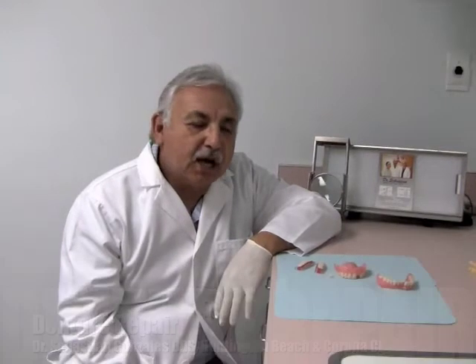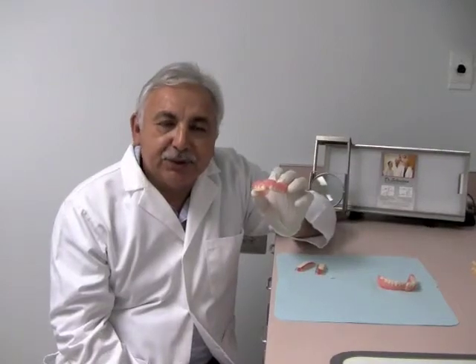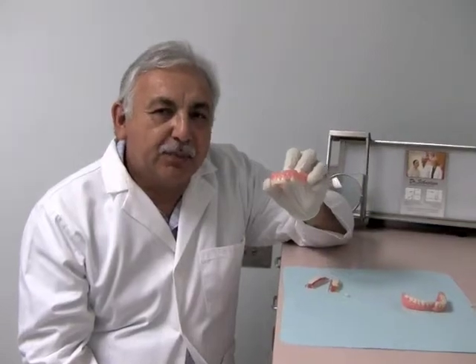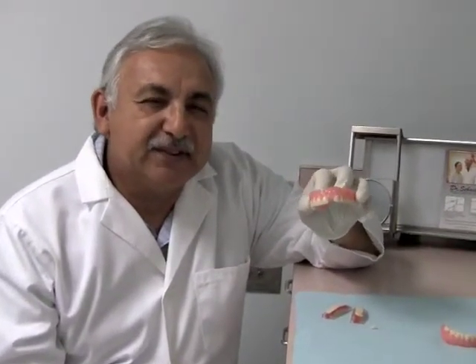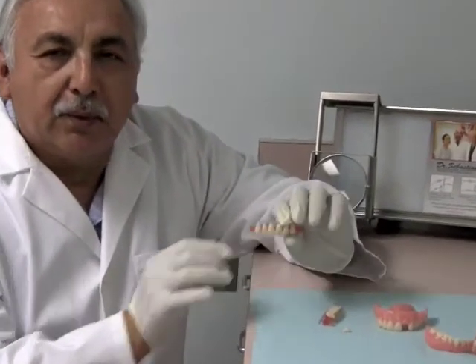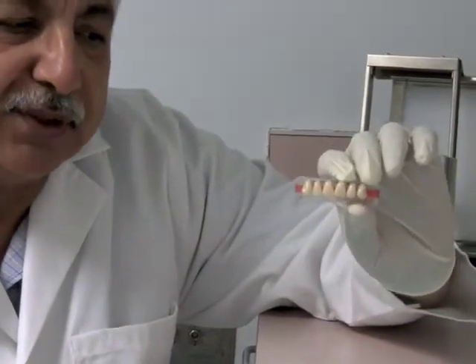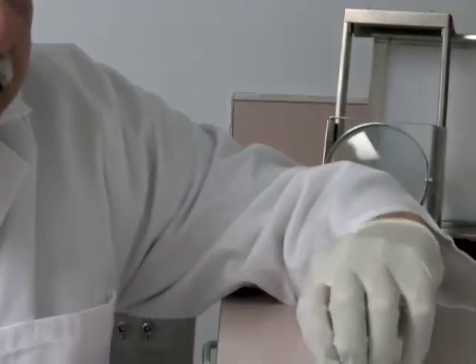The first most common problem is when a patient loses a single tooth or multiple teeth. This usually is a pretty simple problem if the patient brings in their old tooth, and if the tooth is in good shape, it's a simple repair that can be done in the office. If the tooth is not good, then we have to order some new teeth, or if I have one on stock, I will just select a new tooth to replace the denture. That's the most common problem.